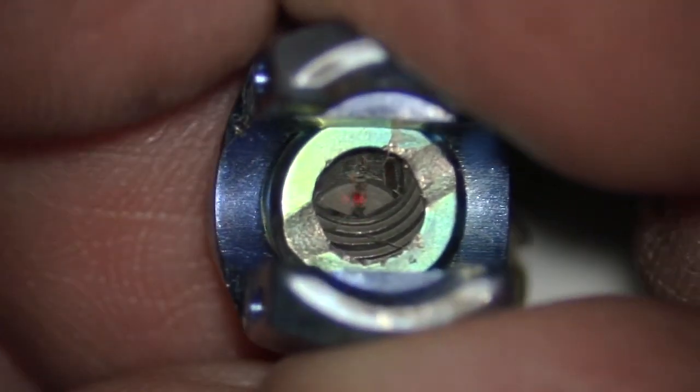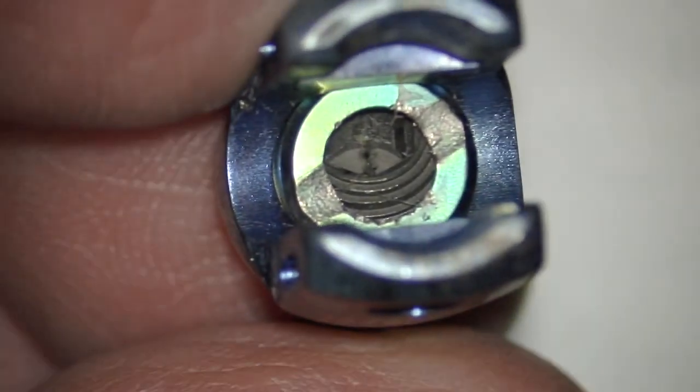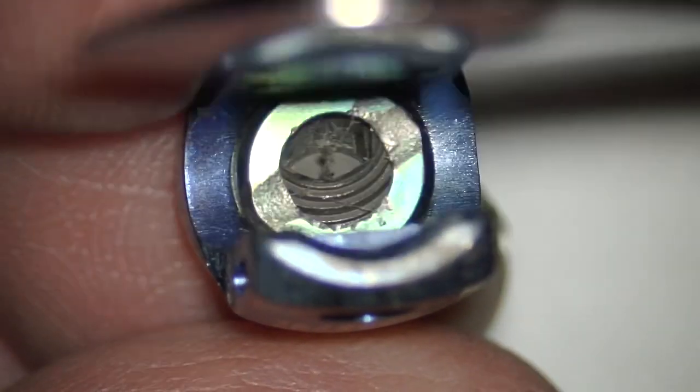So you can see, usually in these deep screws, it's angled like that, where you cannot see the screw head. And if you can't see it, you can't put the screwdriver in it.